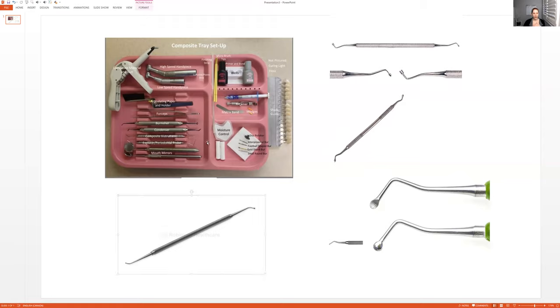And then light cure, and that's it. When they feel it looks the way they want, they have to check with the articulating paper. They will have the patient grind from side to side. You pass the articulating paper and holder to the dentist; they put it in, have the patient tap, tap, tap, and then grind from side to side. Then they will look at that tooth to see if there are any high spots.